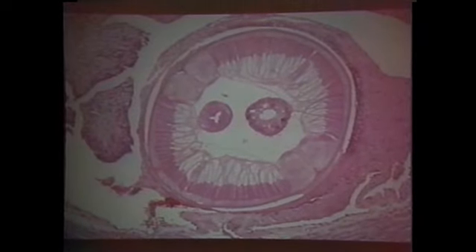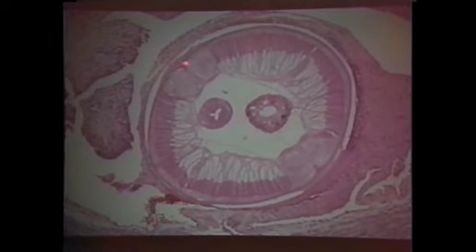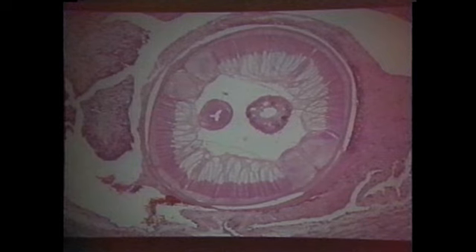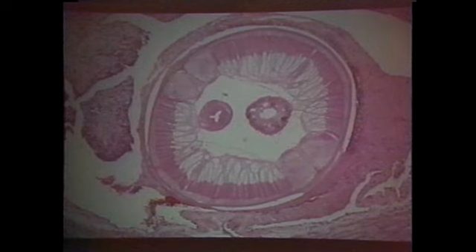All right? And describe it that way. Sometimes the cuticle on the inside, this is lateral cord, by the way. This is muscle. We'll get to these later. But sometimes laterally at the area of the lateral cords, it bulges in right here. Okay? And this forms a ridge. And this is called an internal cuticular ridge. See, it's easy, isn't it?